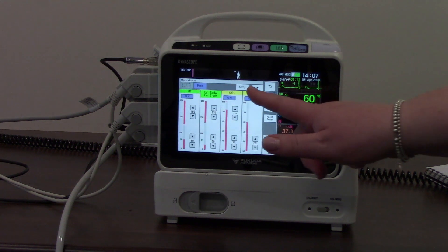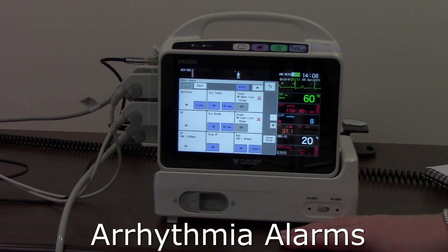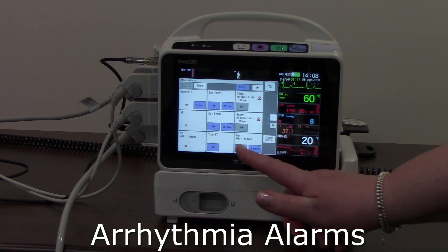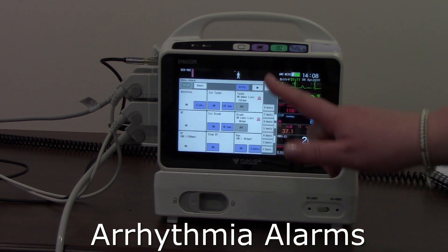I can also go into other alarm menus such as my arrhythmia alarm settings and see how those have all been set up. I can alter or adjust these according to my patient's needs — for example, I can turn any on or off, or adjust accordingly depending on patient need.